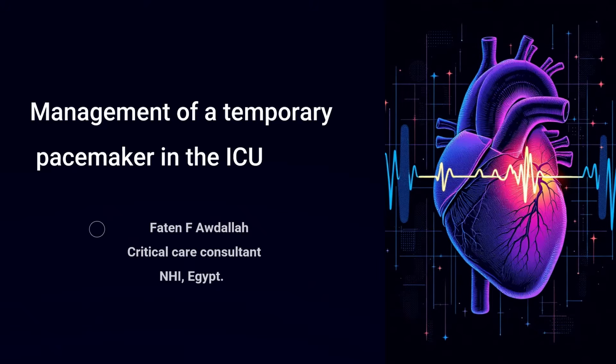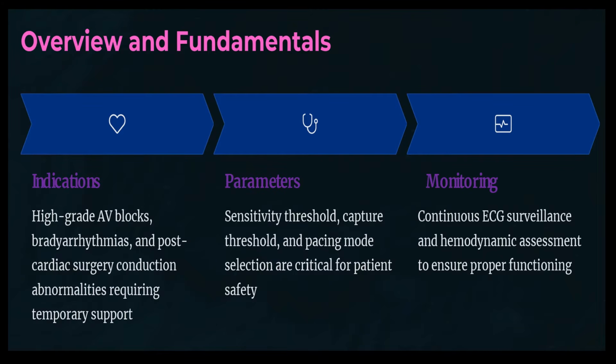It is a short lecture regarding the nursing protocol in the ICU, monitoring of the pacemaker, and the fate of the temporary pacemaker, either removal or shifting to a permanent pacemaker. A quick revision about the overview and fundamentals of pacemakers. It includes the indications of the pacemaker.